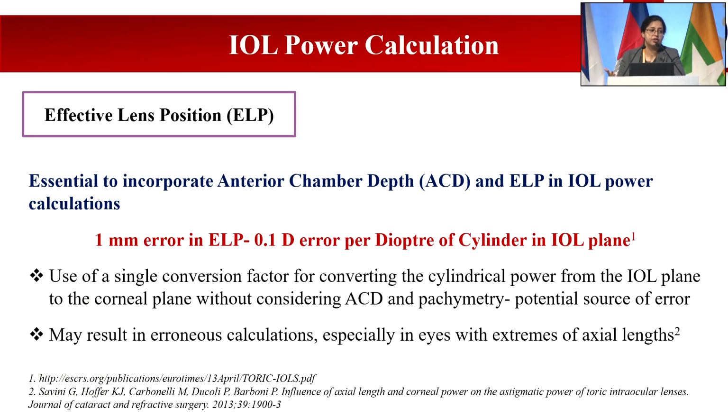0.5 diopters or within plus minus 1 diopter, because however much you may try to predict with a host of variables, 6 variables, 7 variables, still the accurate effective lens position is not being 100% accurately predicted.